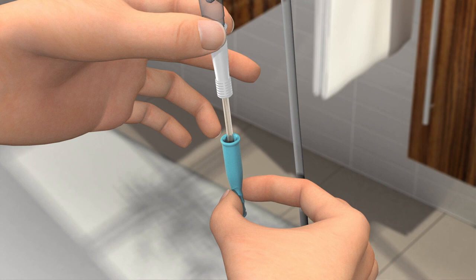Touching the sink, your clothes, or your skin, for example, will contaminate the catheter and can potentially cause infection.